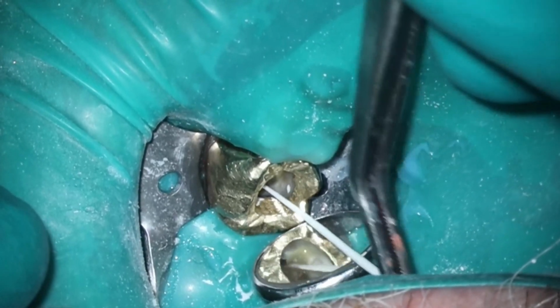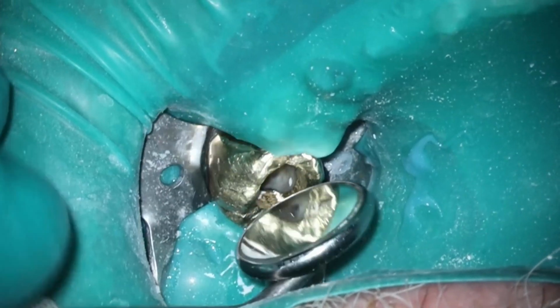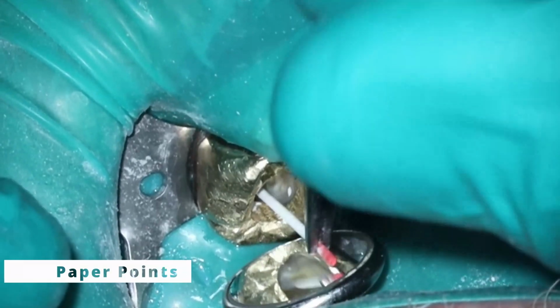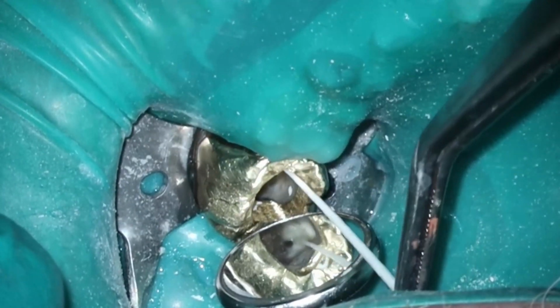We'll do the squirt technique for this one, but I did want to talk, this is a cool video for two reasons. Number one, the misdiagnosis and me getting to rant a little bit about the importance of knowing what you're looking at with cone beams. And number two, talking about the squirt technique and what to do if you can't get all the way patent after running the gentle wave, after running the files.